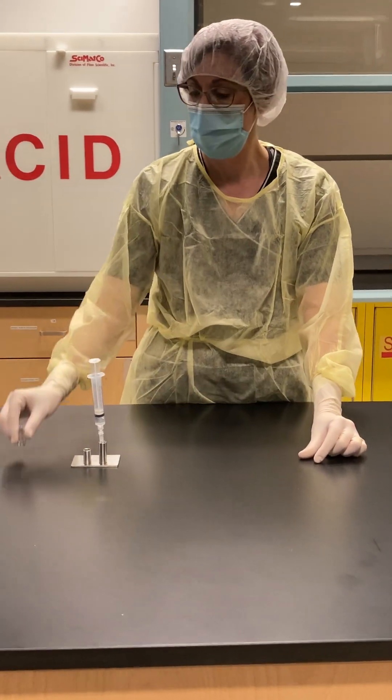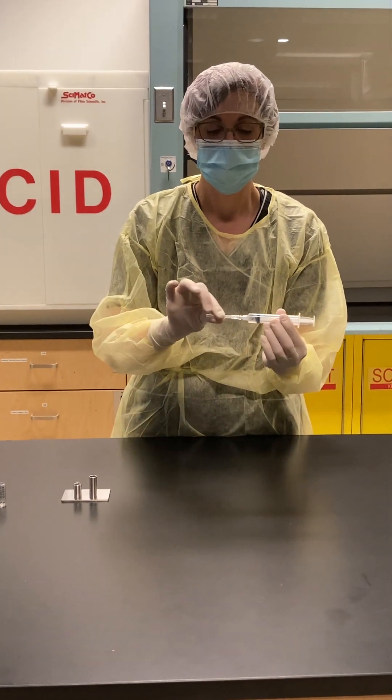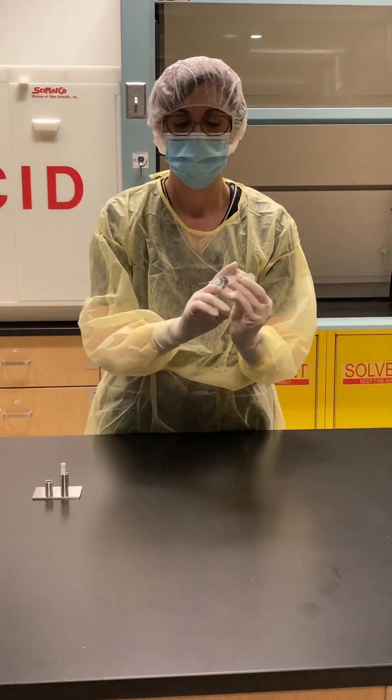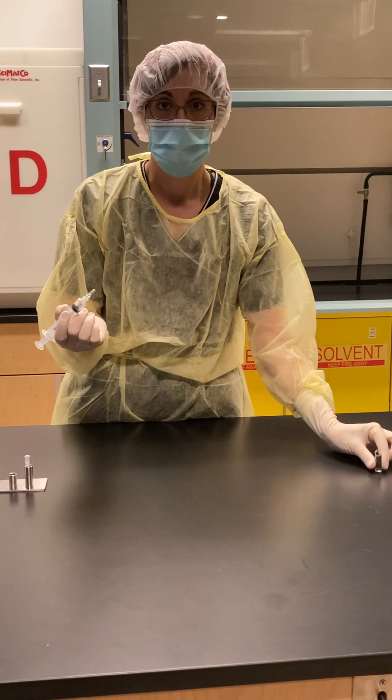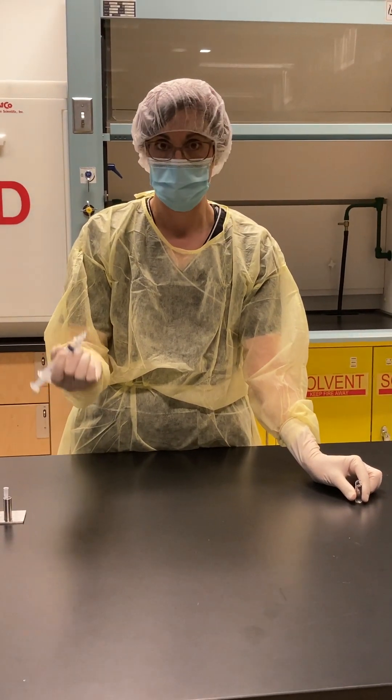I'm going to put my needle in this side of my work surface. With ampoules, you don't have to worry about adding air or using a milking technique.